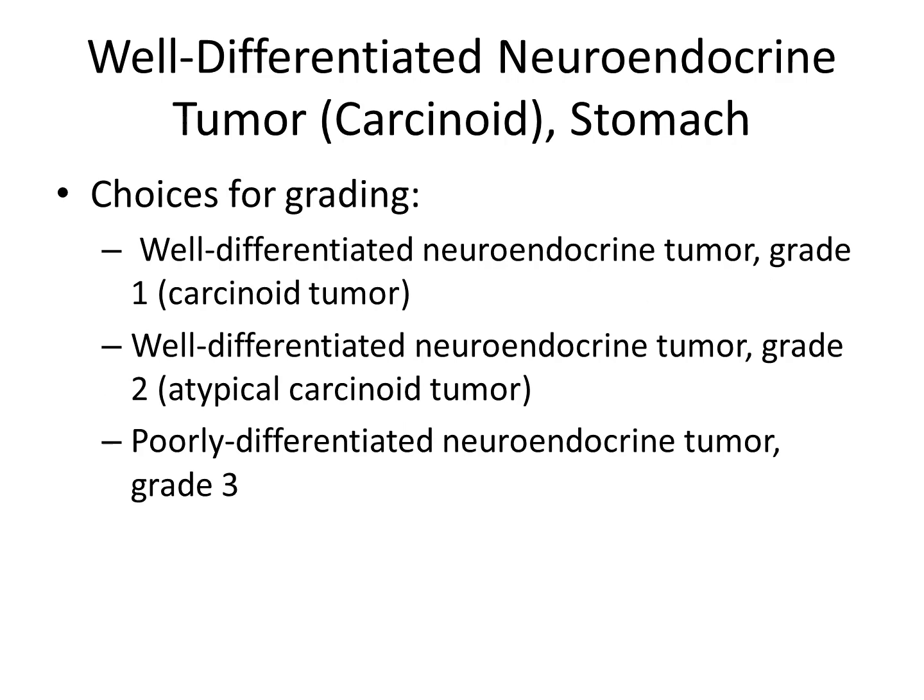Grading of well-differentiated neuroendocrine tumors of the stomach has changed in recent years. First of all, we need to clarify an important point. The difference between well-differentiated and poorly differentiated neuroendocrine tumors is largely based on growth pattern. Well-differentiated neuroendocrine tumors have a distinct growth pattern, including nests, cords, and trabeculae, as we previously discussed. In contrast, poorly differentiated neuroendocrine tumors lack any distinct pattern of growth. Rather, they grow in sheets and generally have extensive necrosis. Now we shall consider only the well-differentiated tumors.